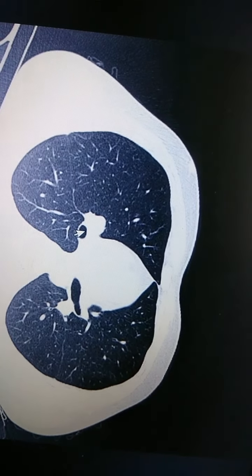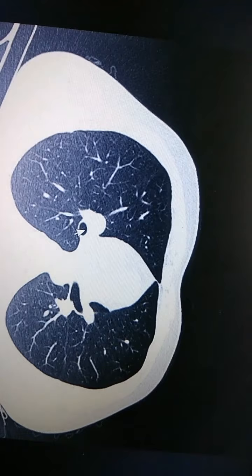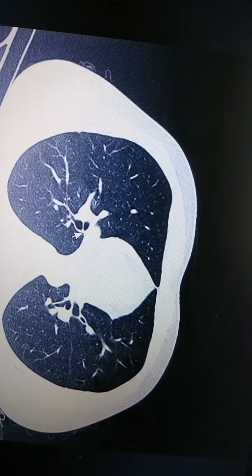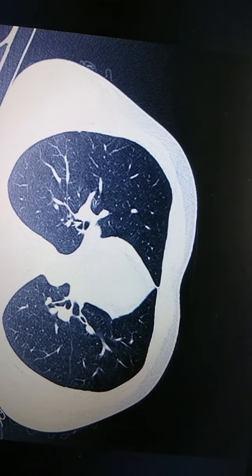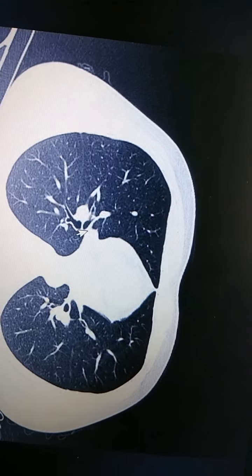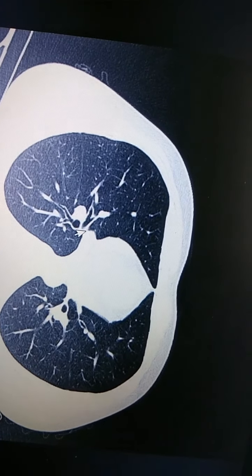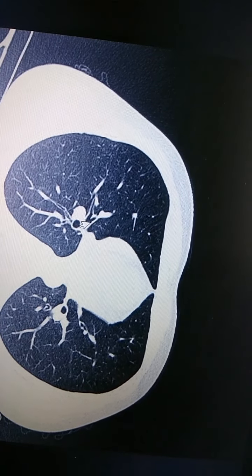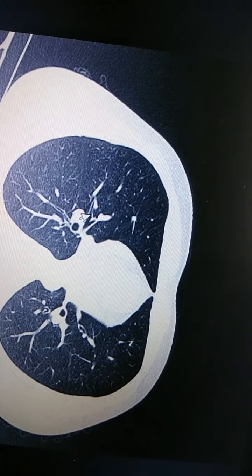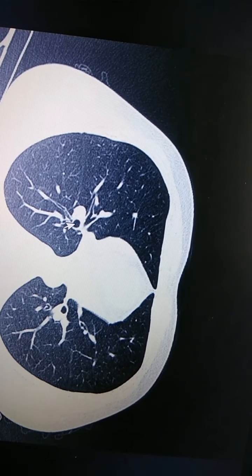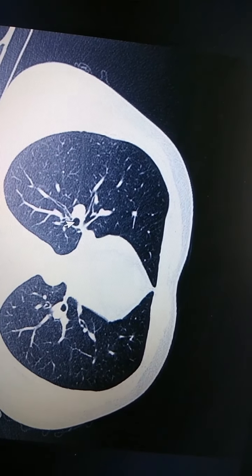This is the bronchus intermedius. Bronchus intermedius gets divided into 2 parts: the right middle lobe bronchus and the lower lobe bronchus. As we scroll down, the right middle lobe bronchus divides further into medial and lateral segments. And this is the right lower lobe bronchus.